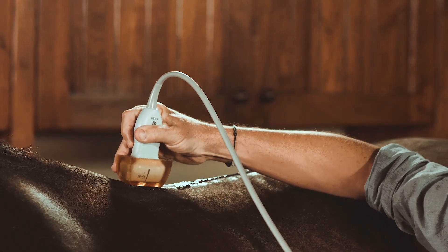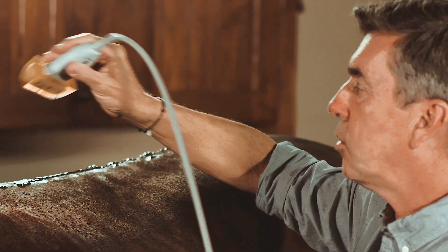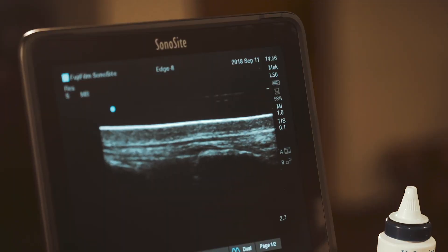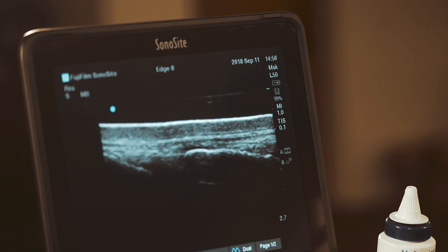We start from the cranial aspect of the back of the horse. You want to make sure that your probe is always directed with the cranial aspect to the left of the screen, and the caudal aspect of the probe showing the right side of the screen as a convention. Don't hesitate to increase the gain to have a nice deep view of the ligament.